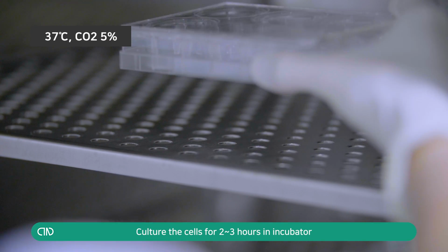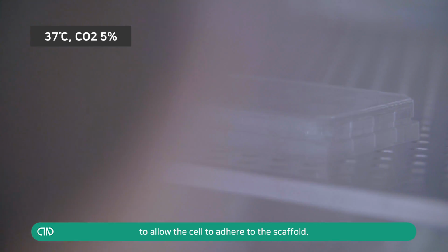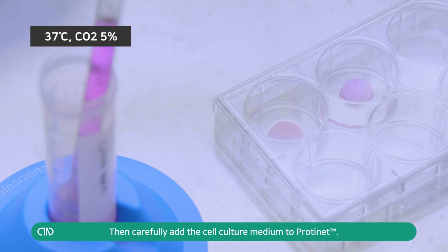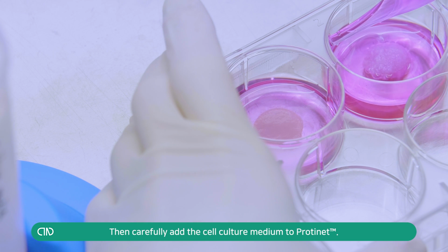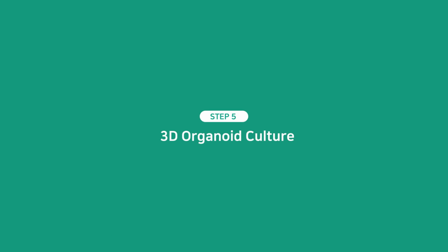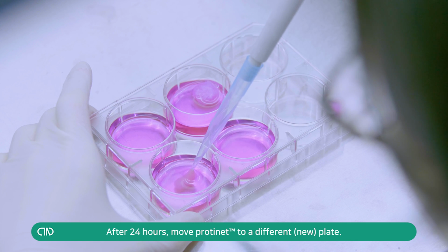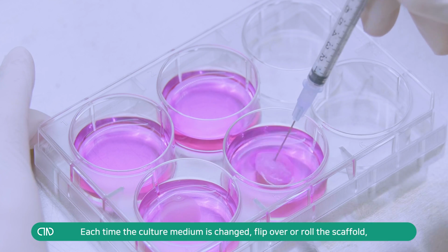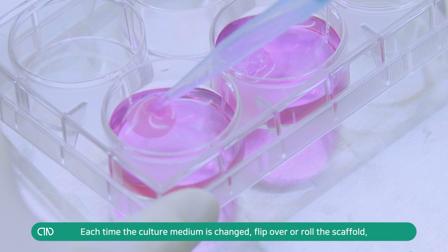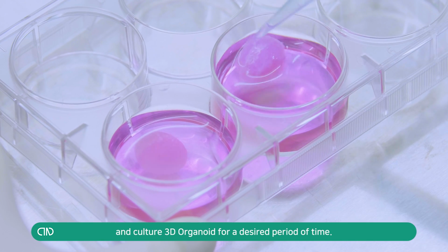Culture the cells for 2 to 3 hours in an incubator to allow the cells to adhere to the scaffold. Then carefully add the cell culture medium to Protinet. After 24 hours, move Protinet to a different plate. Each time the culture medium is changed, flip over or roll the scaffold and culture the 3D organoid for a desired period of time.